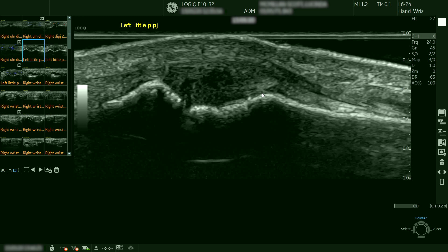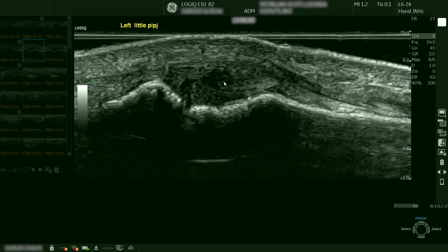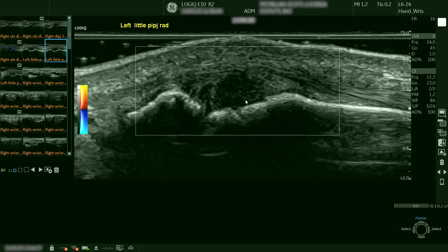This is another area where she had a lump — the left little finger proximal interphalangeal joint — and here we see synovitis on the L624 probe. With colour Doppler there is no flow within this area.